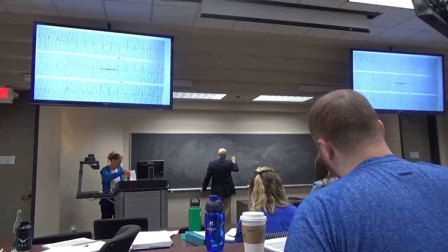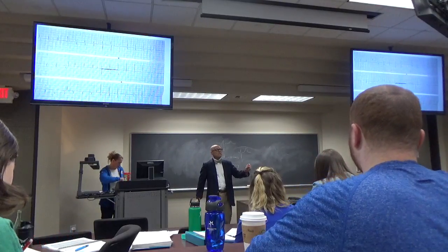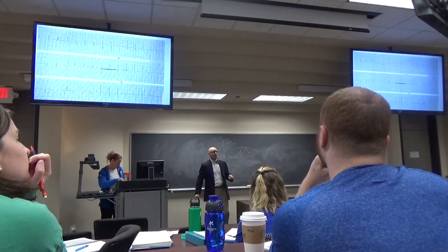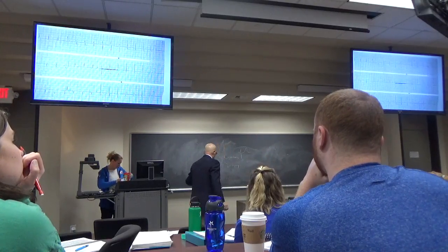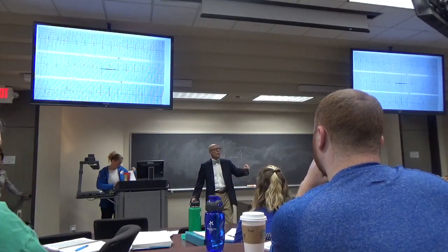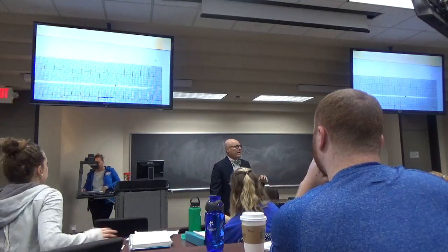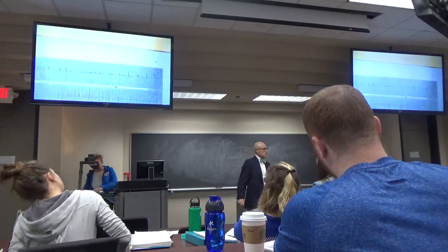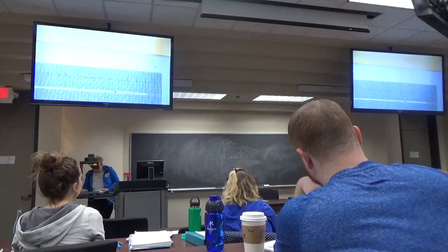So this is an ischemic T wave. The way I think of this is, if I take that ligature off here, that T wave will flip right back upright, and I won't have done any damage to anything. When it's this way, I don't know exactly what's going on in the muscle cell. I don't know if I've left it on too long. I don't know if I can get full recovery, because it's injury pattern. When there's injury to the muscle cell, it's probably leaking troponin. It's probably leaking enzymes into the blood if it's injured.